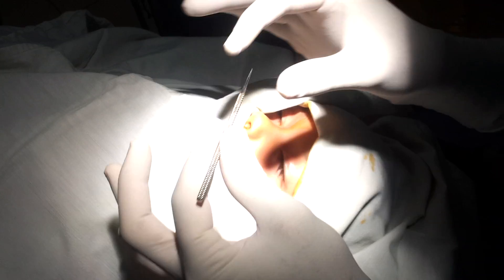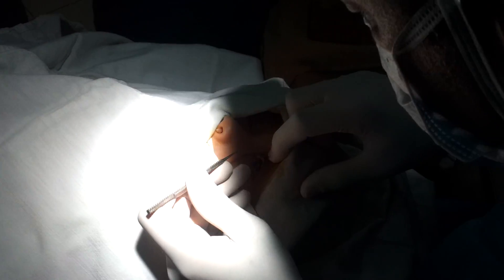Today we will demonstrate the intubation of the lacrimal canal of a three-year-old child. We will use the Nettleship dilator to dilate his puncta.